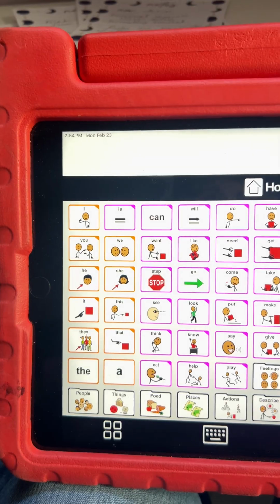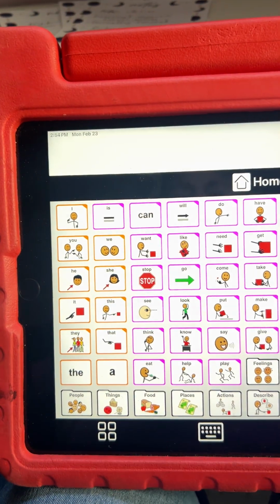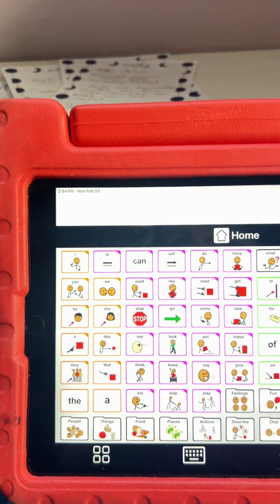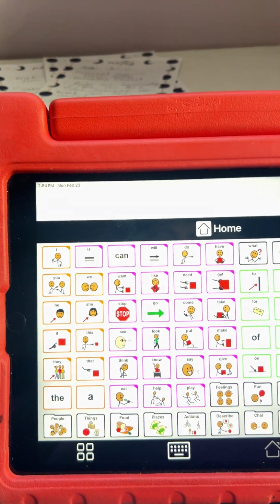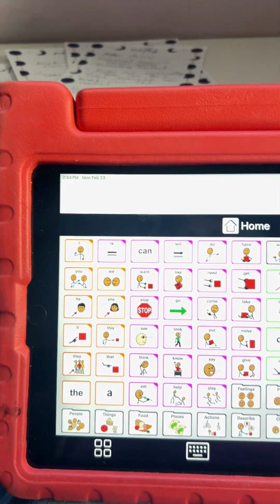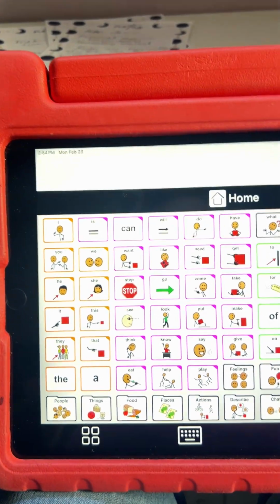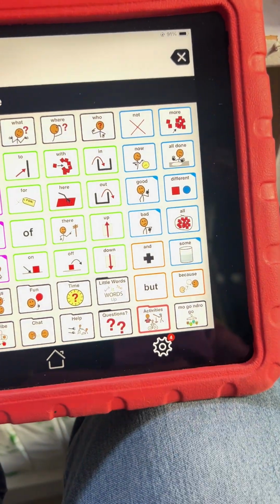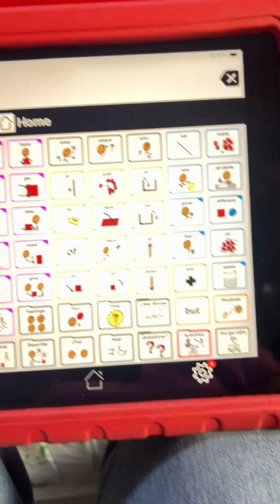So whatever position you are, the teacher, the RBT, behavioral tech, aide, paraprofessional, parent, you are the one modeling it, because it takes a lot of modeling and a lot of practice to get to where this is actually going to be an effective communication device, right?